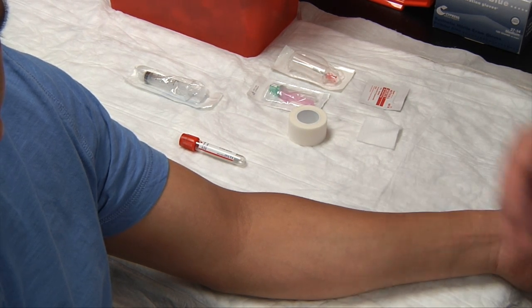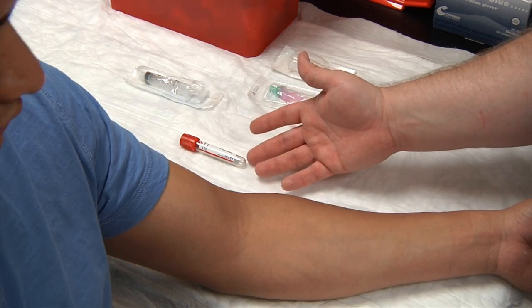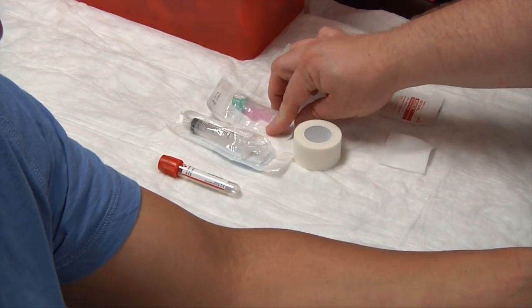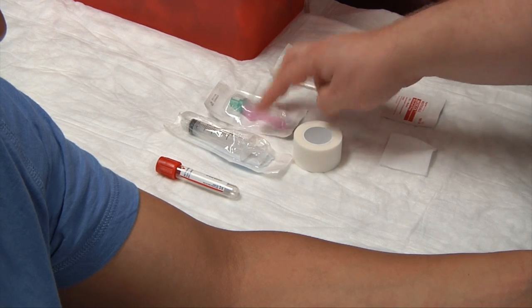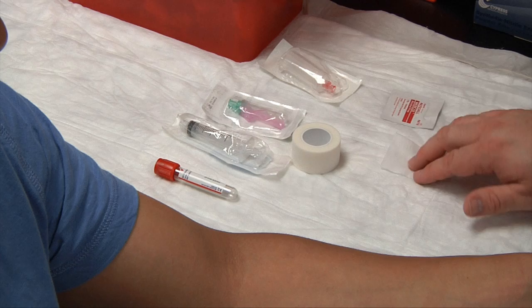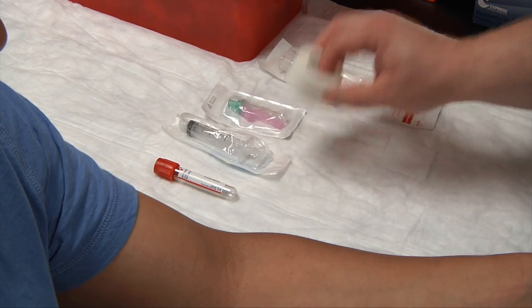The equipment we're going to need is our evacuated tube, a barrel syringe, a hypodermic needle with a safety cap, a transfer device, gauze, and alcohol swabs.